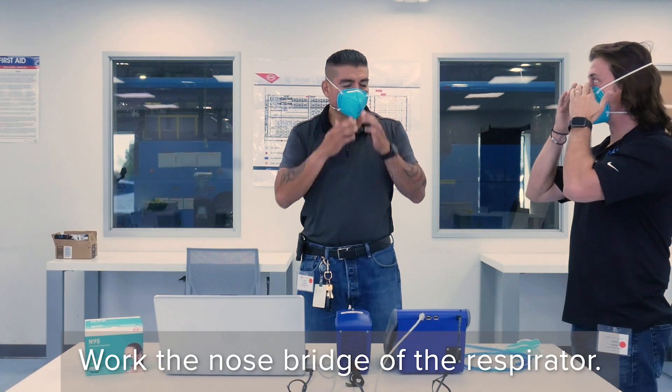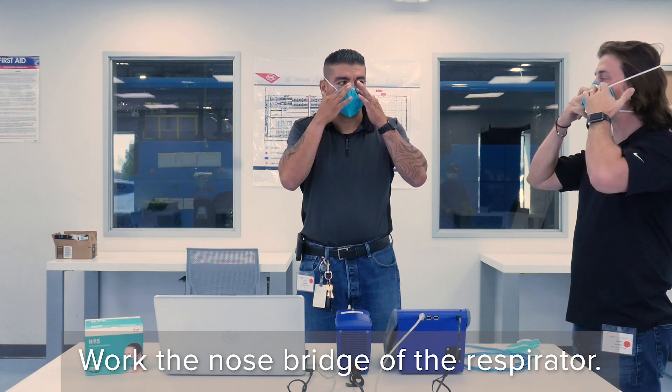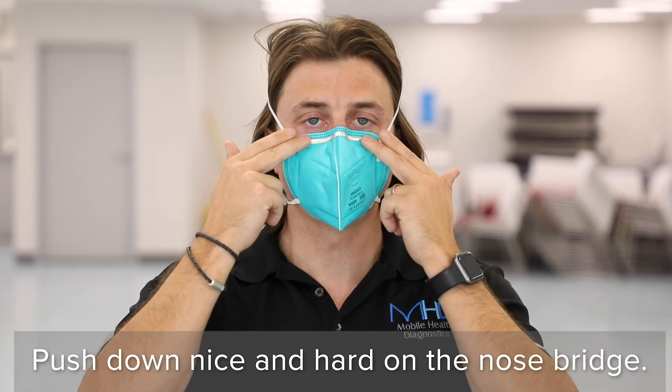Take two fingers on two hands and work the nose bridge of the respirator. Push down nice and hard on the nose bridge, up and down.